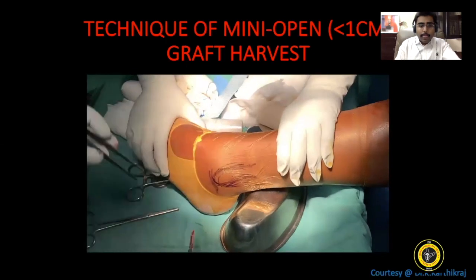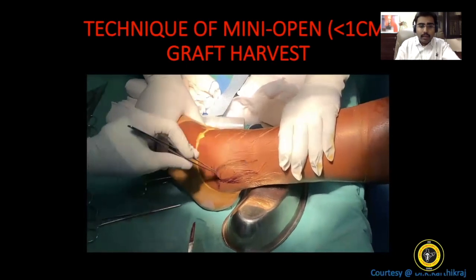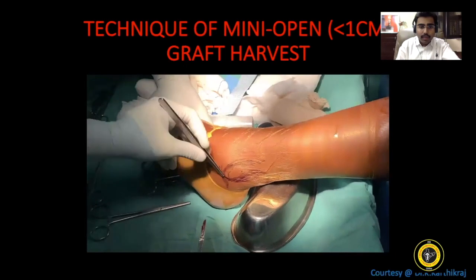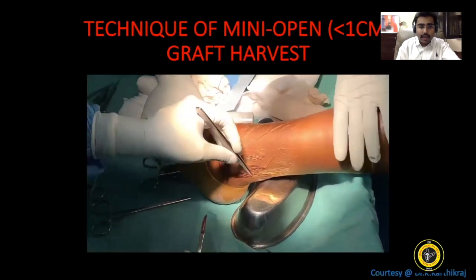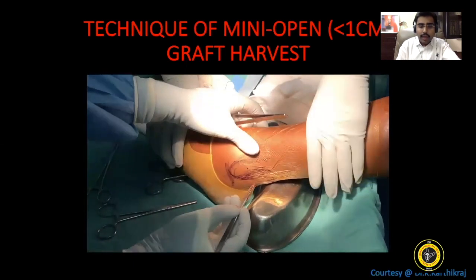Now here, I illustrate the landmarking done over the distal fibula, showing you the distal most tip of the fibula through a vertical line there. And I've also drawn the retromalleolar tunnel where I don't want to go. And as I told you, my three finger breadth landmark is where I put my 7 to 8 mm skin incision. Now, once the skin incision is made, carry out a blunt dissection, and immediately below are the two brothers.